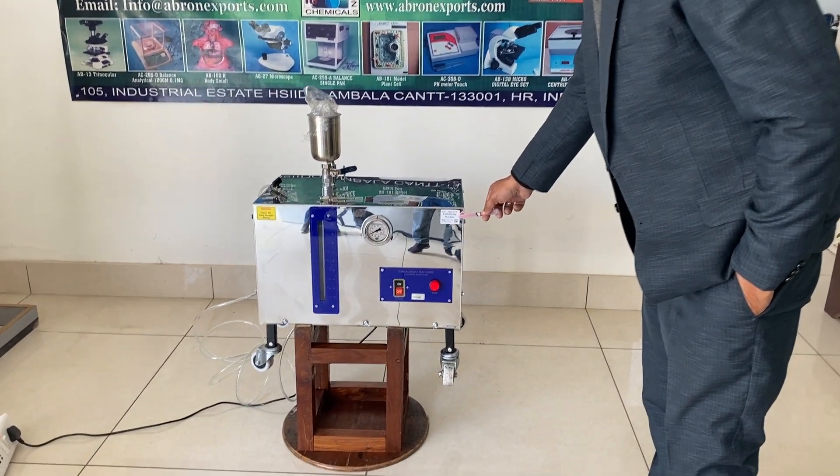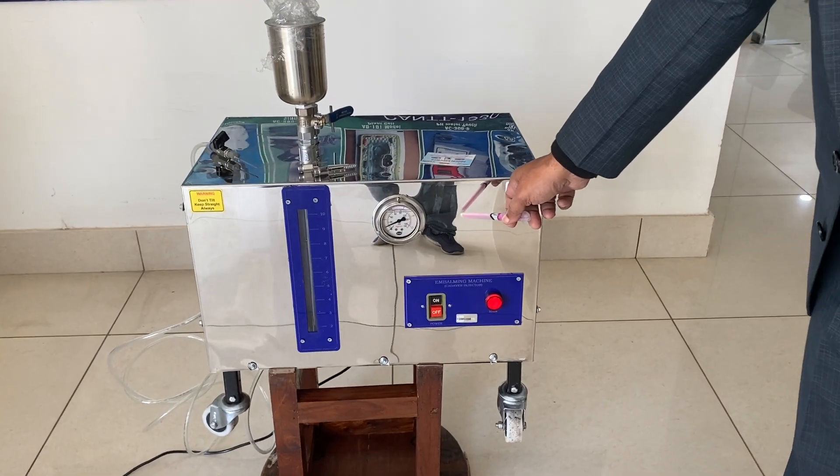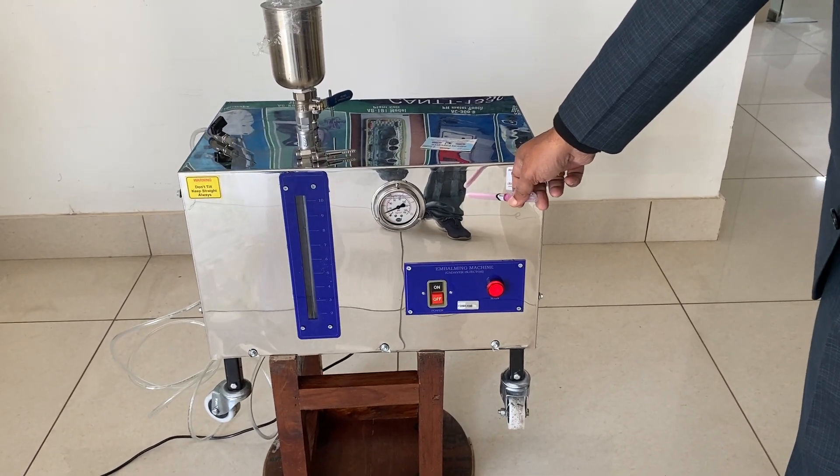This is an embalming machine by Abron Exports. It has a pump inside which runs on oil. There is another model which comes out to be oil-free.